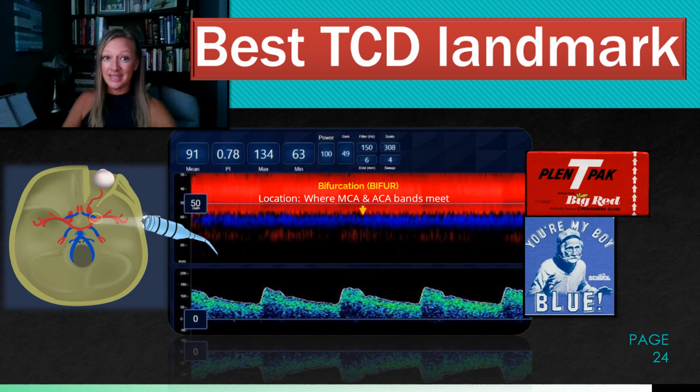The best TCD landmark is where the MCA meets the ACA. Big Red meets Boy Blue. This will reorient you when you're scanning and you are not sure what vessel you're in, where am I scanning? You can go back to your MCA ACA bifurcation to reorient yourself to continue on and verify the location you are scanning. So the MCA is seen here, big red, 30 to 60, and there's your boy blue, ACA, 60 to 70.